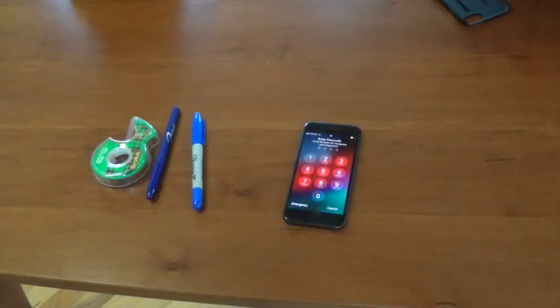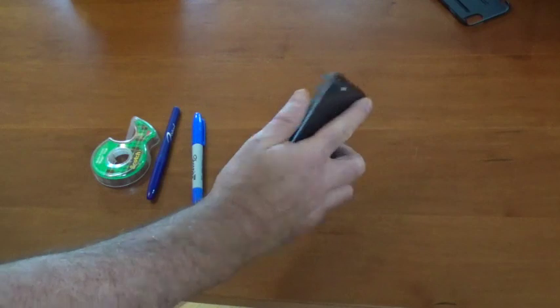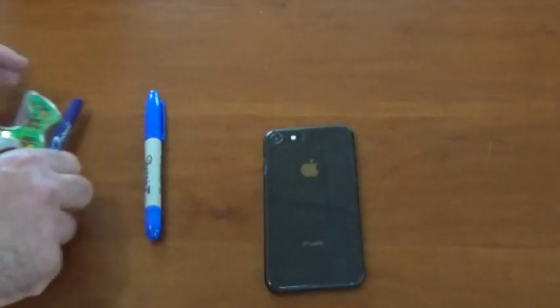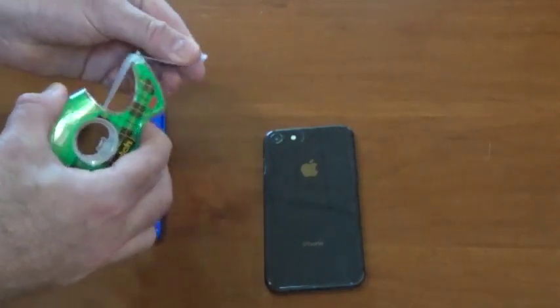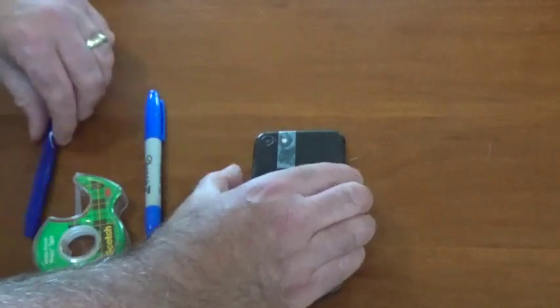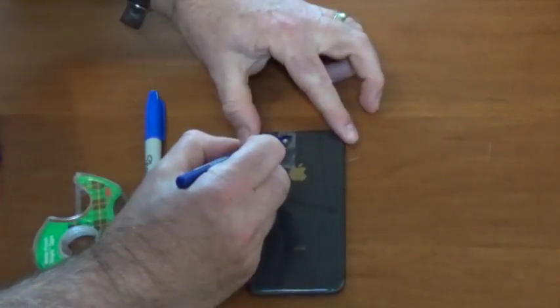If you need to evaluate a patient for a corneal injury but you don't have a Woods lamp, you can use your iPhone. On the back of your phone, you'll see the camera aperture and the LED, which is used for illumination and flash. Put a layer of scotch tape over the LED only, and then draw over it with either a blue Sharpie or a blue tissue marking pen.